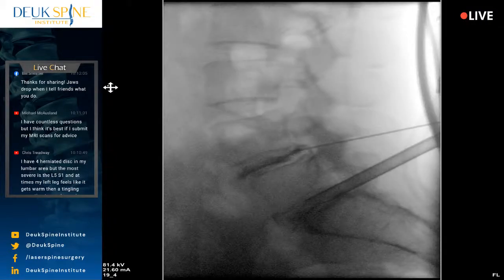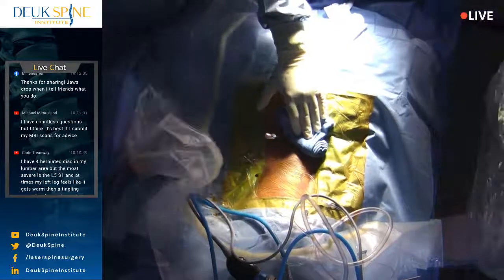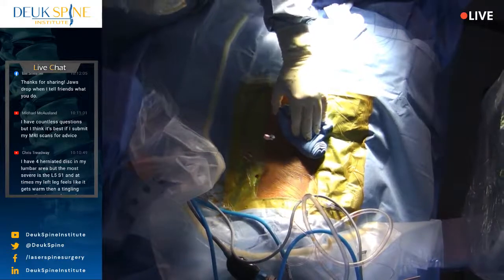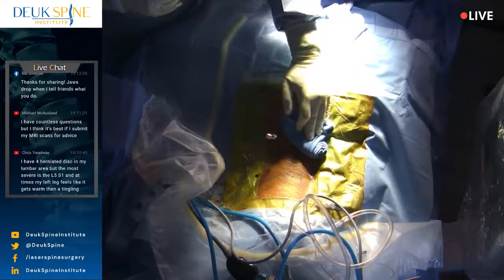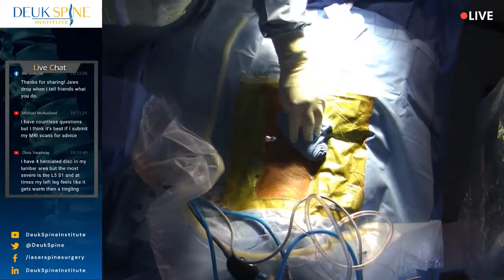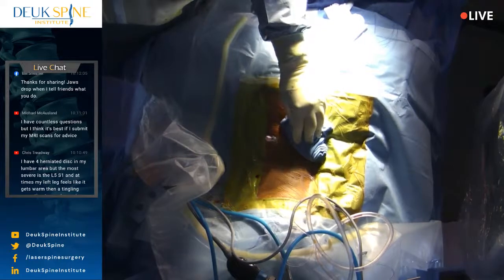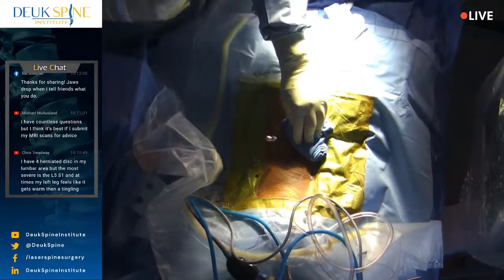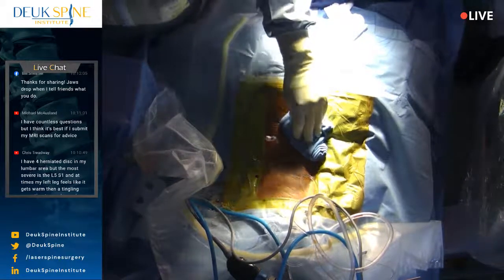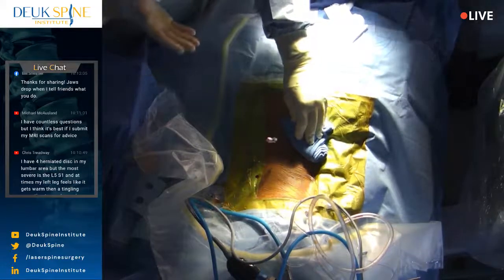So what have we done? We've made a cut in the skin that's a quarter inch. We've separated the muscles with a little dilator, which doesn't damage the muscles at all. And after we pass the muscles, we enter the foramen. And the foramen has just some fat in it, so you're not really doing any damage in there. And then we pass right through the annular tear and disc herniation together. So literally, there's no damage done anywhere to this patient's back at all.